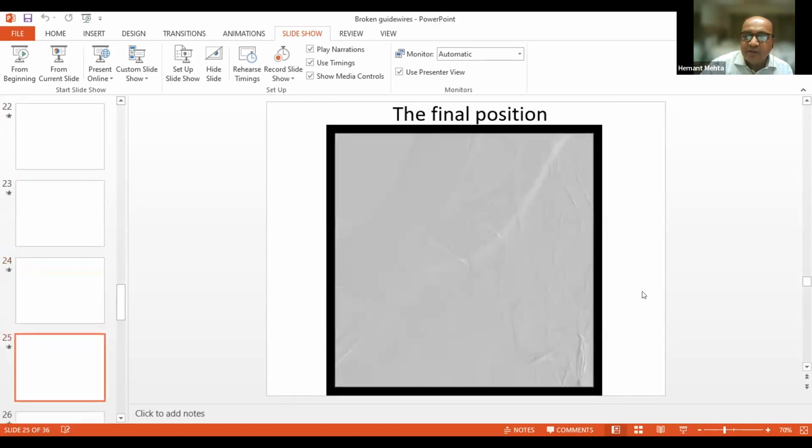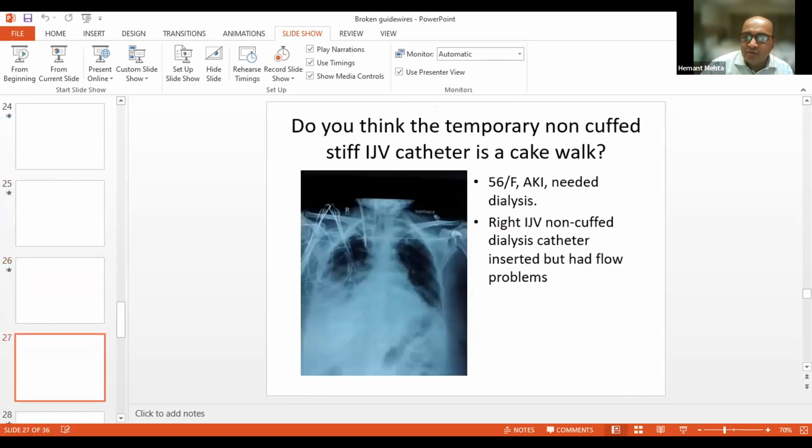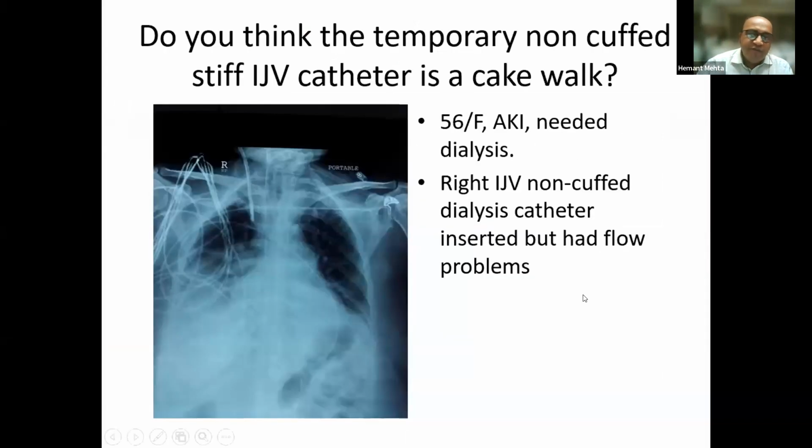Okay, so that was one. And then let me take you through this. We always think that a temporary non-cuffed catheter in the IJV is a cakewalk, but you can be in trouble with that also. So this was a 56-year-old female, AKI, who needed dialysis.